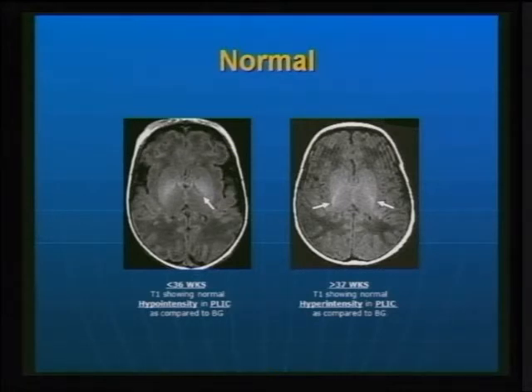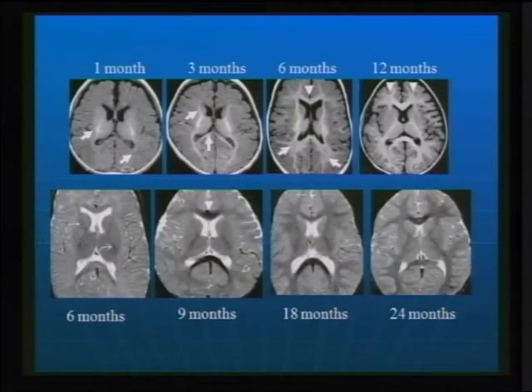This is very important because early ischemic changes secondary to a perinatal hypoxic ischemic event will affect this area and will show you deficiency of myelination, so that the myelination in the posterior limb will not happen as early as it should, and that's one of the early signs of hypoxic ischemic events and injuries.